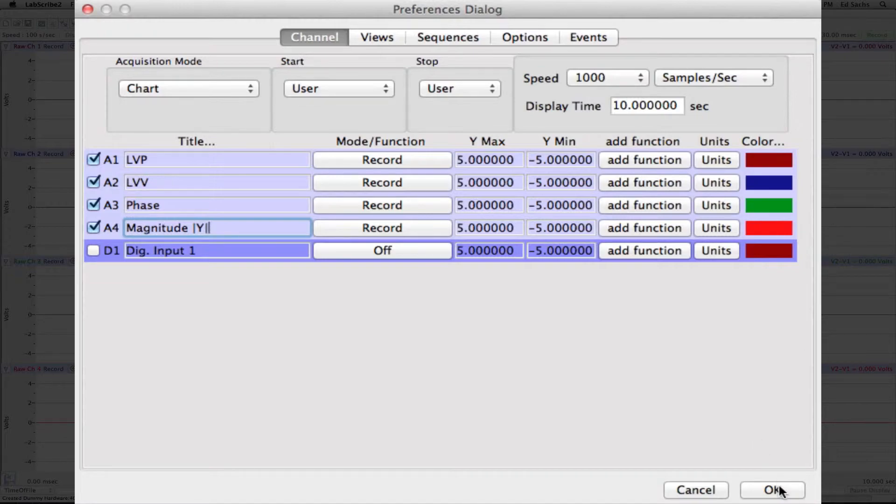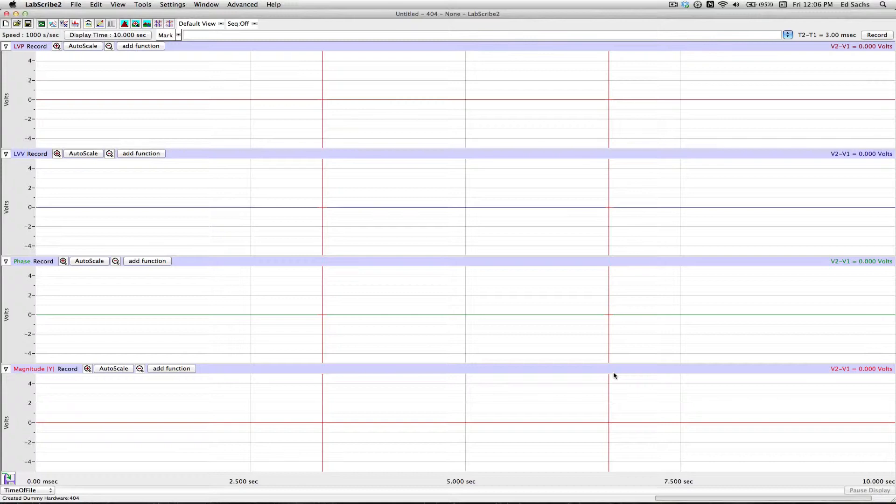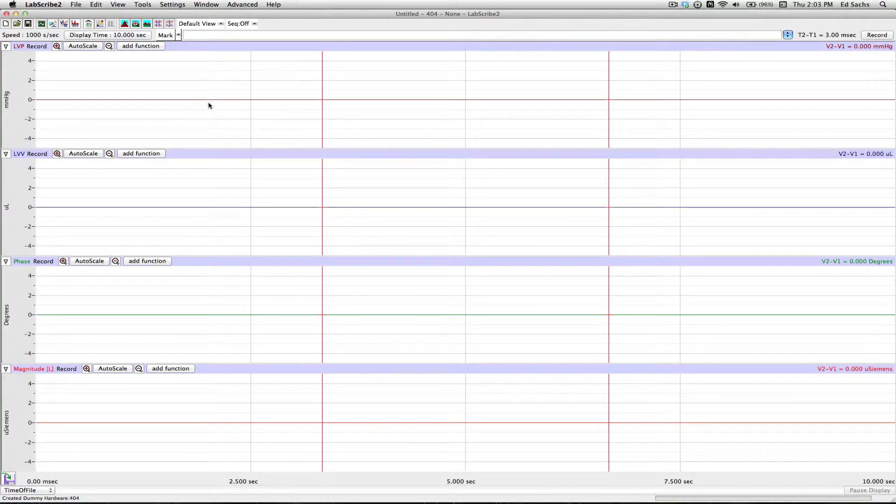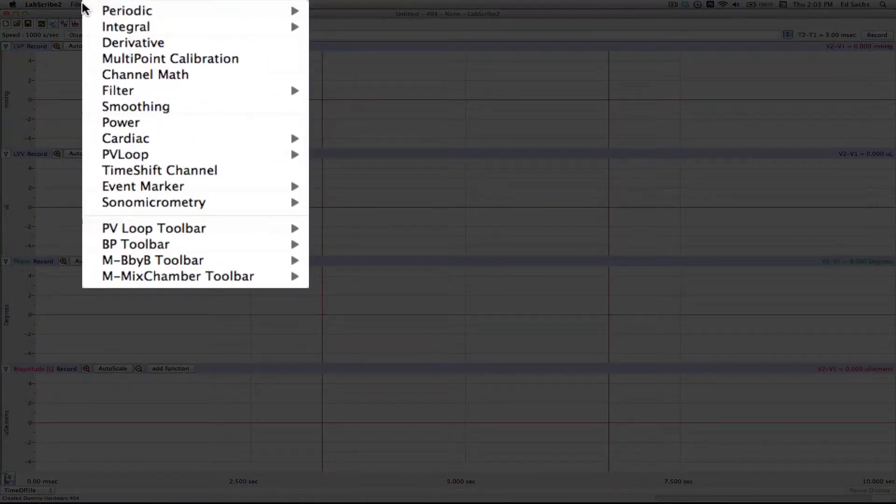We hit OK. Now, I'd like to add a derivative to the first channel. So to do that, we go up to the top here, go to Add Function, and I'm going to choose Derivative.